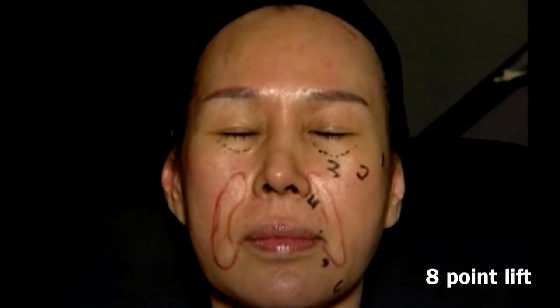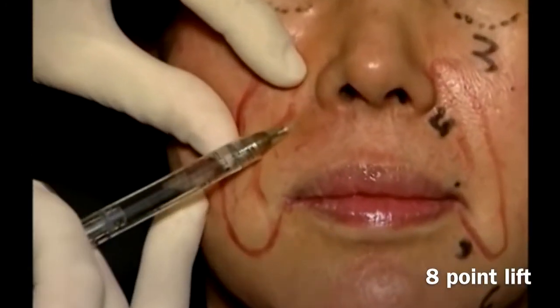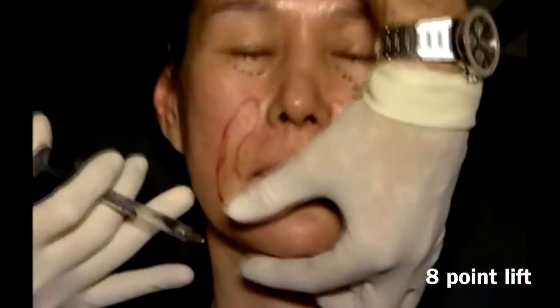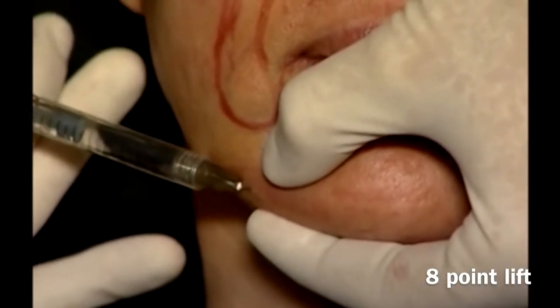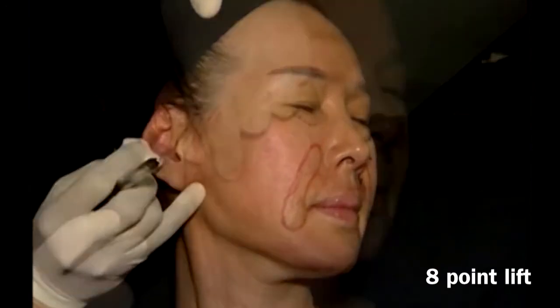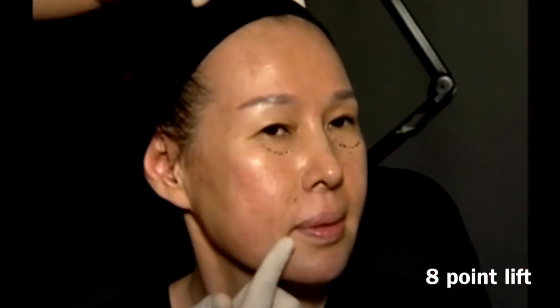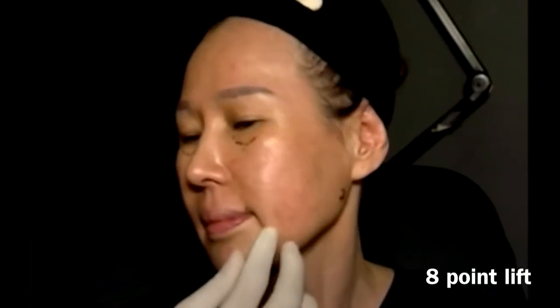In this patient, I skipped point 3 and proceeded directly to point 4, changing to Ultra Plus in the nasolabial fold. Skipped point number 5 and went back to Voluma in the pre-jowl sulcus. Point 7: bolus in the subcutaneous. We evaluate that there is a real improvement at the marionette lines in this patient.